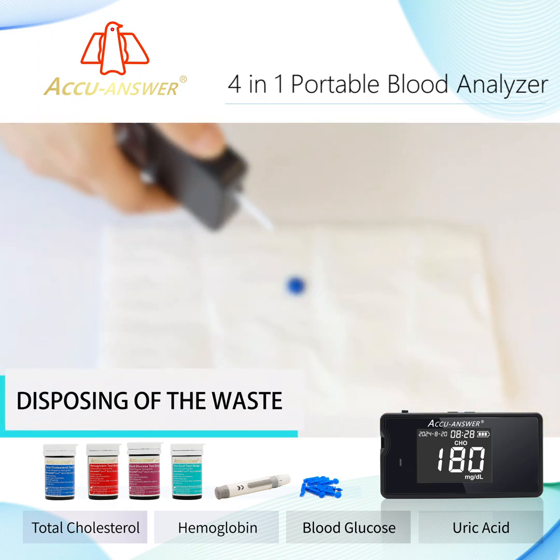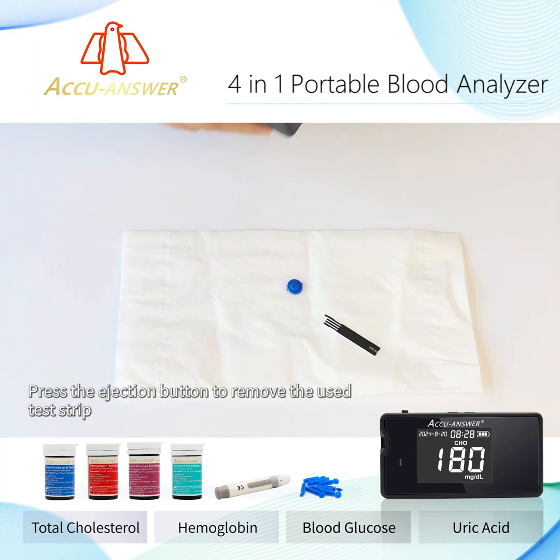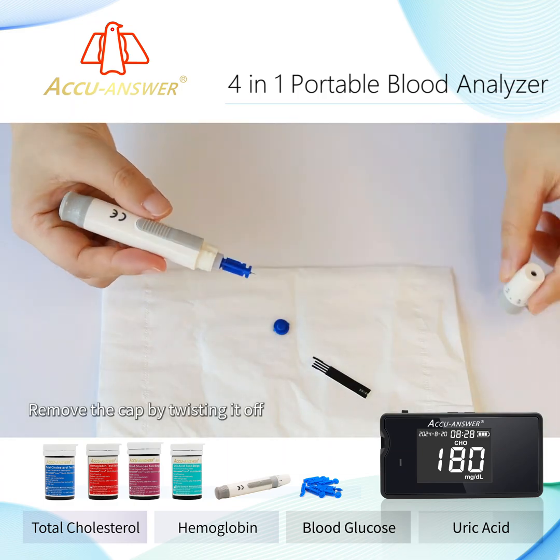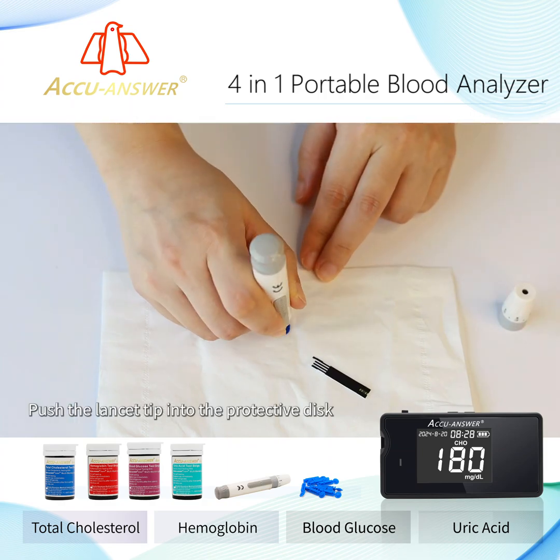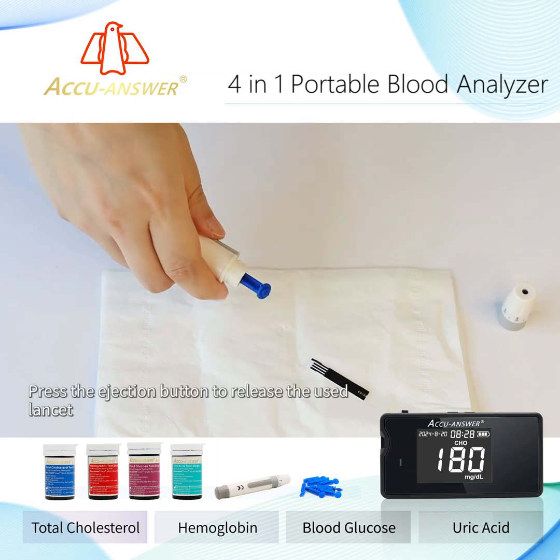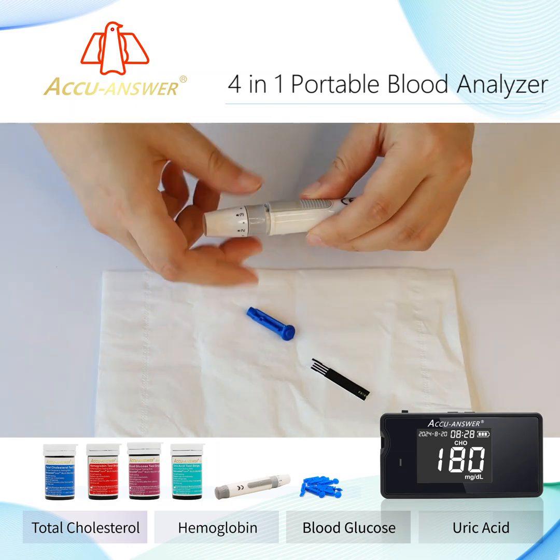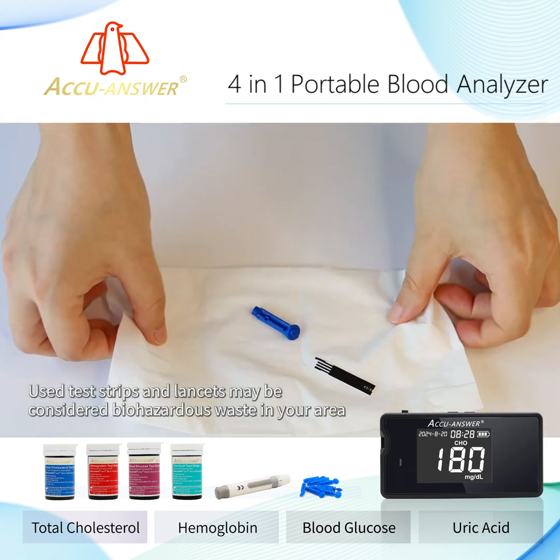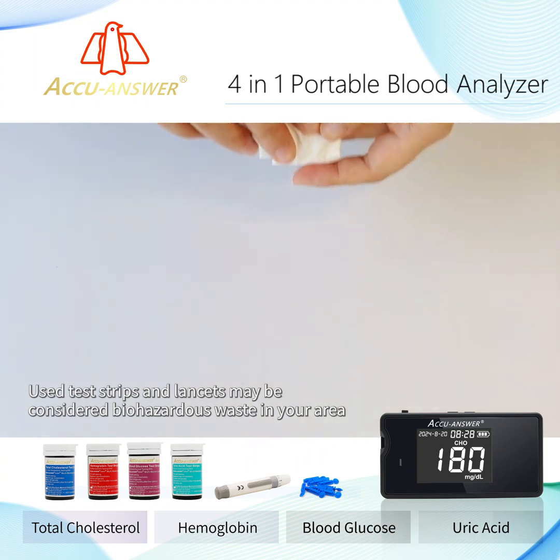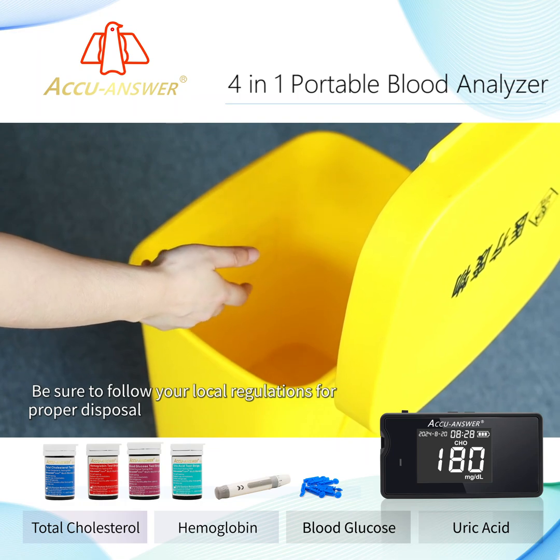Disposing of waste: Press the ejection button to remove the used test strip. Do not reuse disposable test strips. Remove the cap by twisting it off, push the lancet tip into the protective disc, and do not reuse disposable lancets. Press the ejection button to release the used lancet and replace the cap. Used test strips and lancets may be considered hazardous waste in your area — be sure to follow your local regulations for proper disposal.